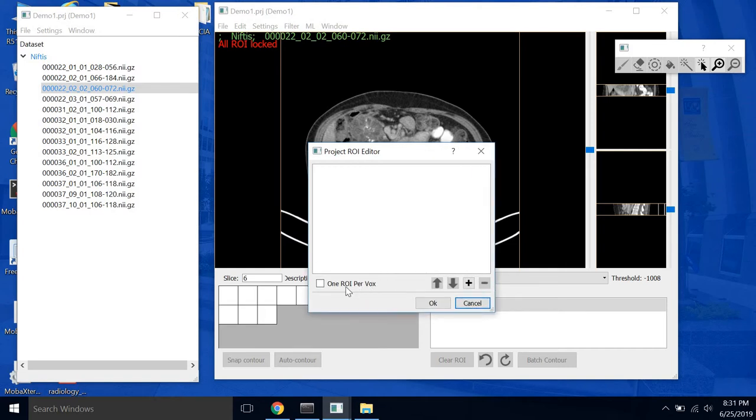Go ahead and select one ROI per voxel. This makes it so that we can only paint one ROI for every pixel that's in the image.